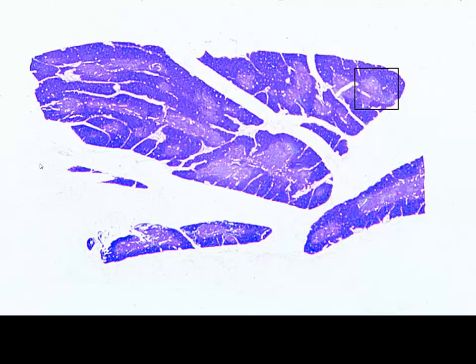All right, shifting gears a bit, and hopefully when you look at this image, you recognize a difference immediately. We're no longer in lymph node, but the organ that we're looking at here, if you'll recall back to our lecture podcast, this is thymus. We can see the outer darker cortex versus the lighter medulla. We can see the lobes and segmentation, so this is thymus.